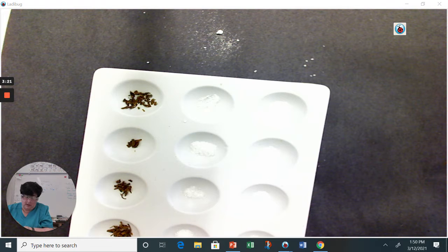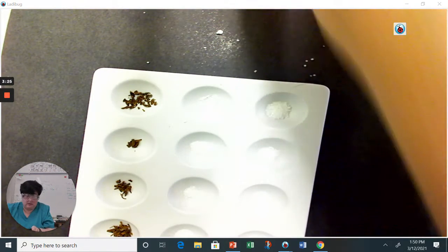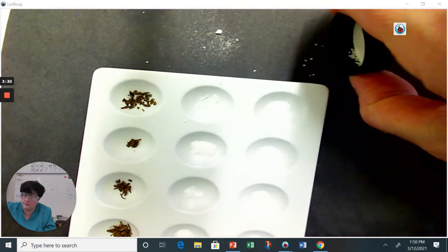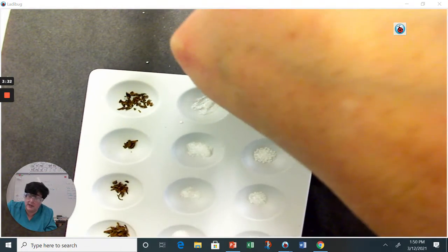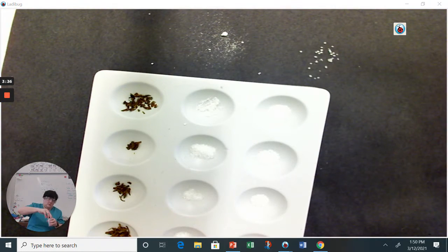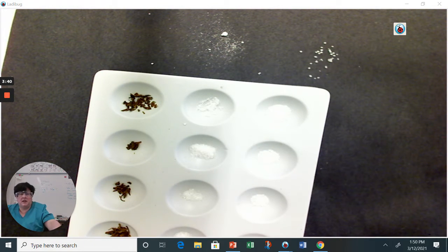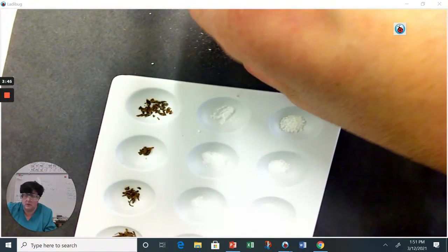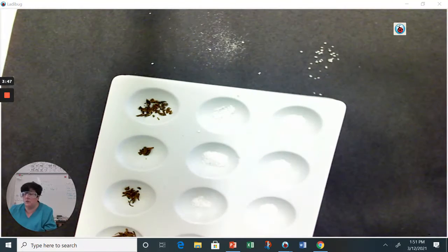Transfer a little bit into the cap so I have a little more control. This likes to roll, so this may not work out too well. Oh, and it's very electrostatic. I can see it sticking to the plastic cap. Again, it's simulated, so it's not how that particular powder would work. That's a piece of powder I'm going to get rid of.